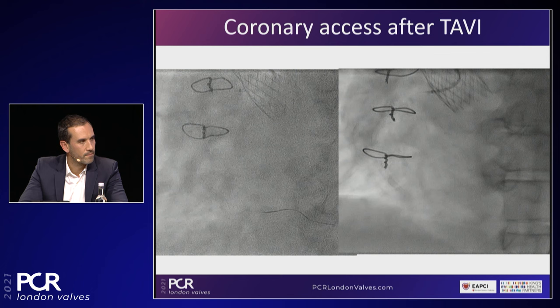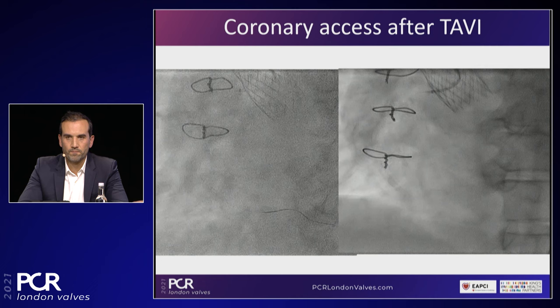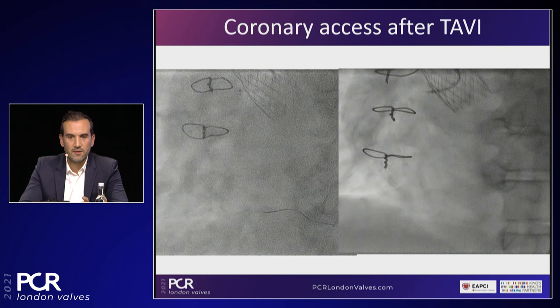Seeing this case, it brings us to the question whether this should be done by every interventional cardiologist, or would you recommend sending to an expert center performing TAVI, after TAVI for PCI or angio, sent to an excellence center? Yeah, I think this case, again, that is extreme, is here to illustrate that you just need to understand where the flow is and where it is coming from. But as soon as you have understood that, I think most of our colleagues have a lot of experience in coronary PCI, and there was nothing really difficult regarding the PCI itself. What was difficult was to understand where to go. So I would say it's just a matter of training, education.